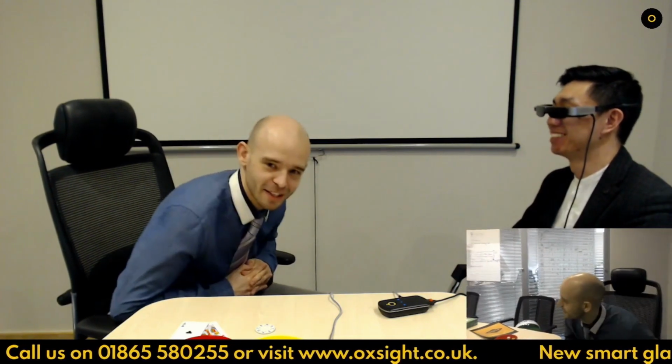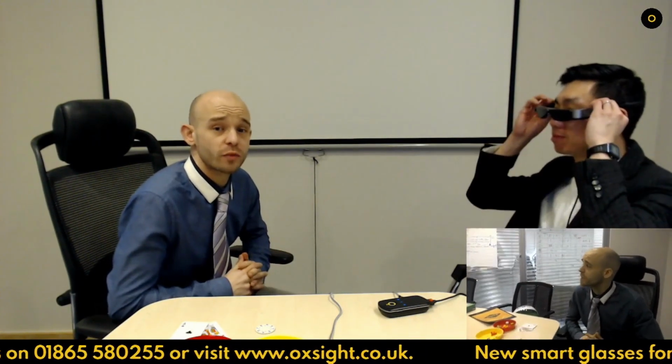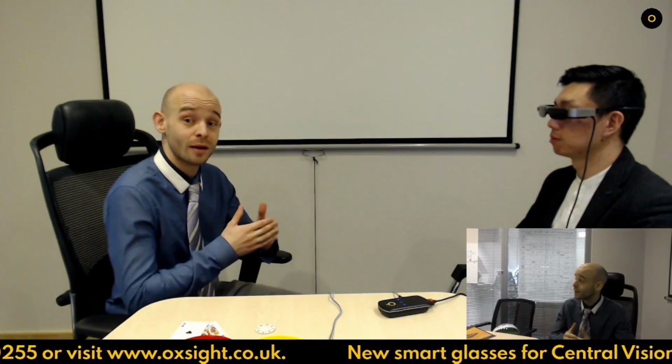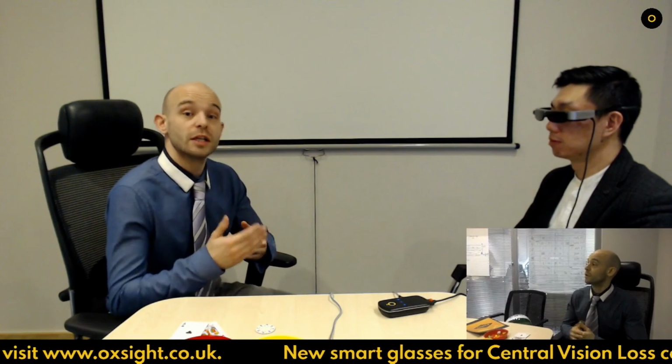Thank you, thank you. What you will notice is I do look a little bit further away. Now the reason for that is we are taking 68 degrees of field of view and we are pointing into a small area of the eye. And basically when you do that, you have to push the image back. So that's why things look a little bit further away.